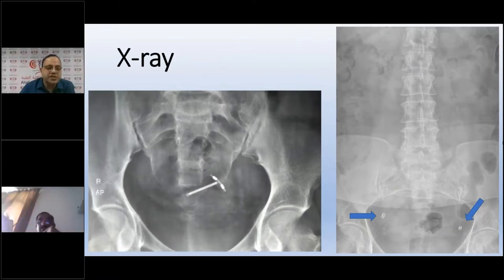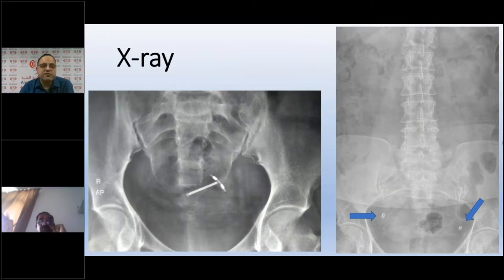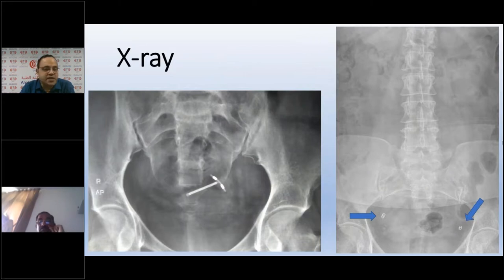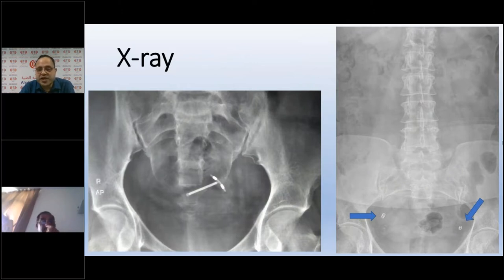X-rays can be used for IUCD localization. When evaluating X-rays in females presenting with pain, we may see tubal ligation bands — small radiopaque shadows or metallic densities that are bilateral and symmetrical in the pelvis. These should not be confused with renal stones.